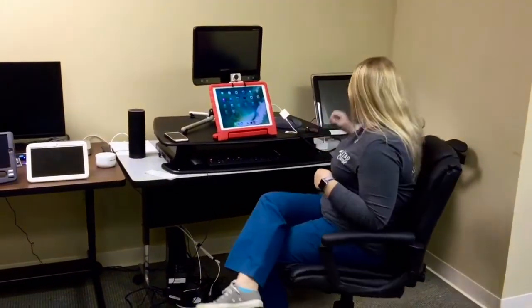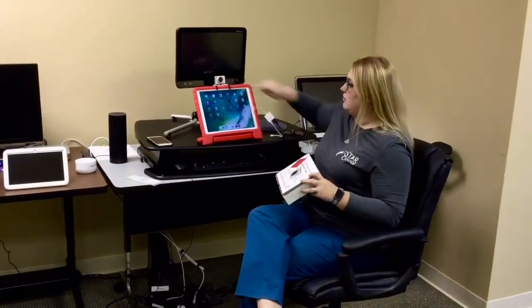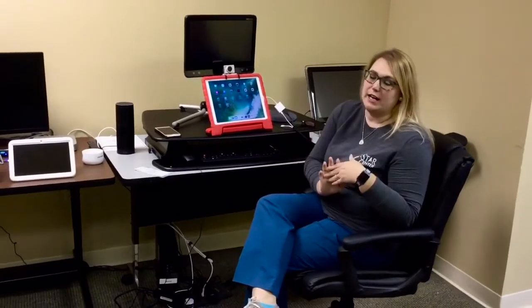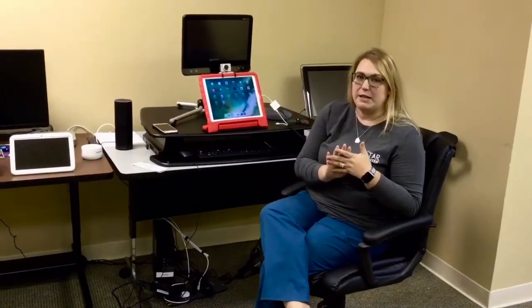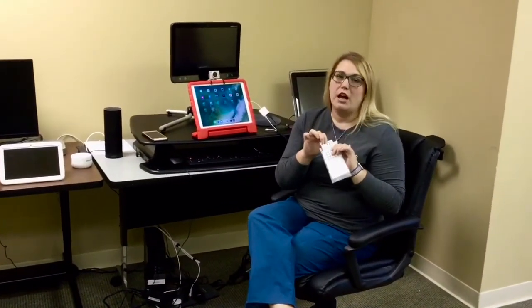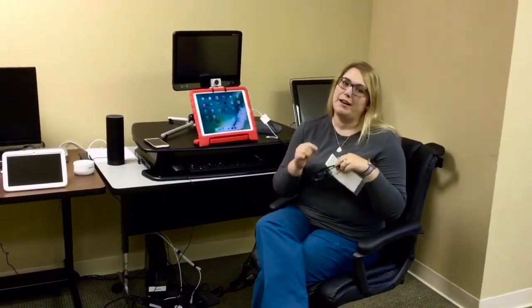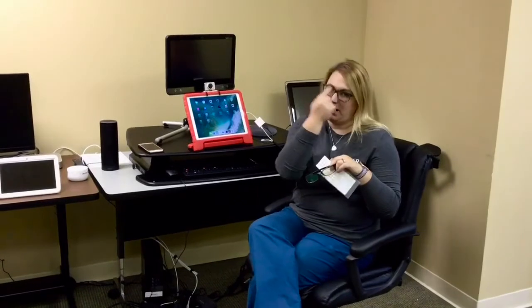Okay, so we're going to talk now about a head mouse, which can also be used to operate a device without direct selection. A head mouse, like the Nano, is what we're using. We've attached it to the iPad. It can be used with these little dots on a multitude of surfaces. Directly on your forehead. We have them on a pair of glasses. You put on a hat. Anything that would be right around your forehead.